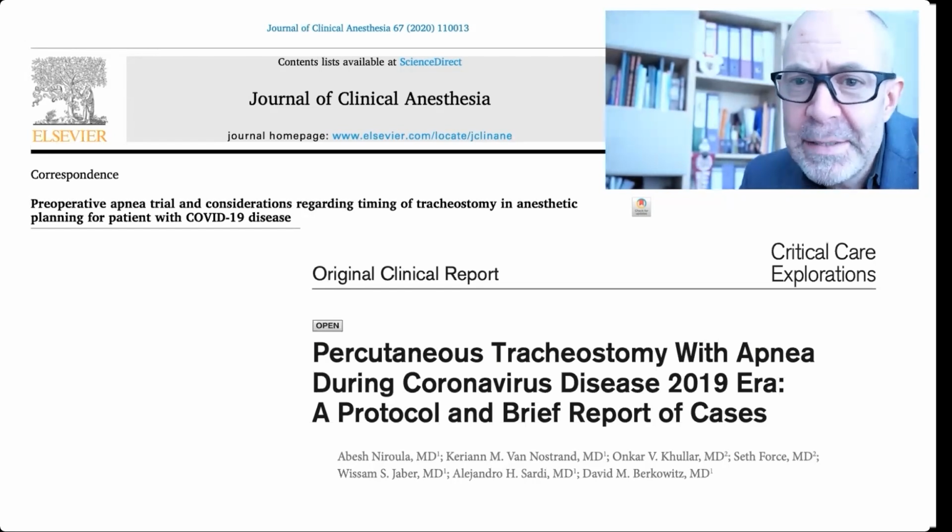I certainly wouldn't mandate it, but if you're worried about suspending the ventilator, particularly for a patient with highly infectious respiratory disease, then you want to check that they're going to be able to tolerate the procedure before you do it. The time to find out that they will not tolerate the procedure is whilst the neck is open, the patient is hypoxic, and you're desperately trying to re-establish ventilation.